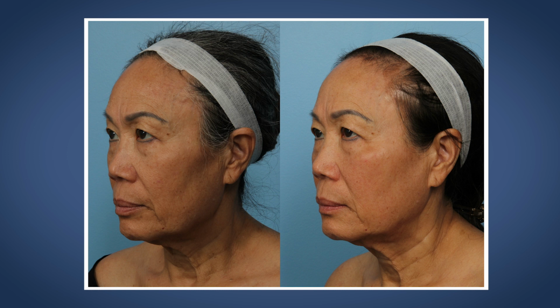The first treatment, actually this is a single treatment. She has since been back to my office to do a second go around. But this was a single treatment with the Moxie. So a level 3, or like I said, we do manual. So it was 15 millijoules, 15% coverage.